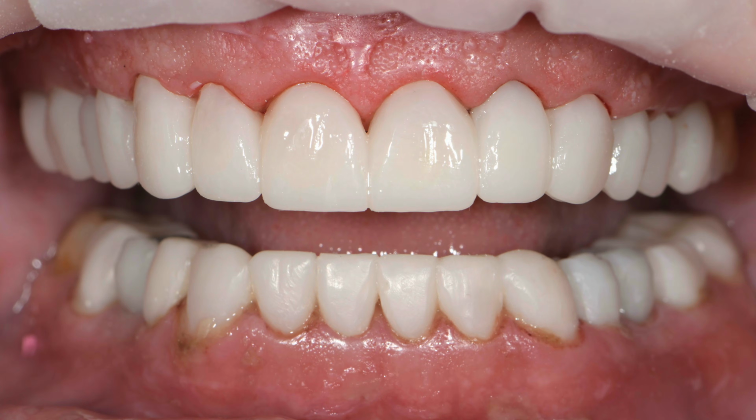And then we make the provisionals. The day before I made the lowers; this day I'm making the uppers. And typically they go in pretty well and everything's good. There's usually some adjustment, obviously, just because even with a very accurate wax-up, seating that over a full arch without any stops, although we had one stop on each arch, is a little bit tricky. You don't always get everything perfect. I'm looking forward to next year printing provisionals and maybe eliminating some of the adjustments that are inevitably needed when you're making them in the mouth. So these turned out pretty good.